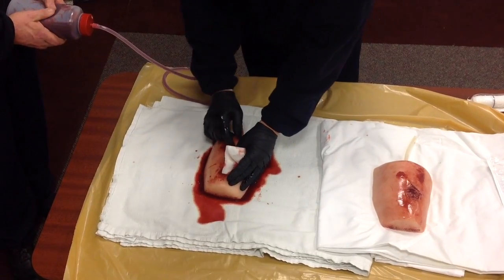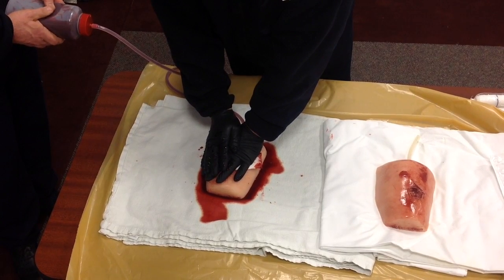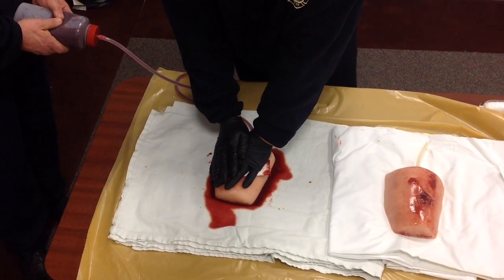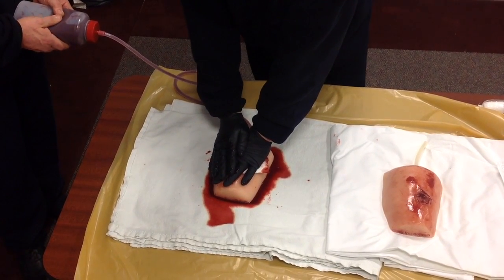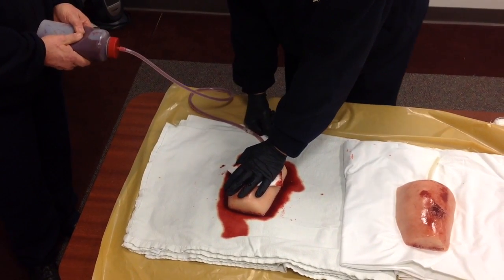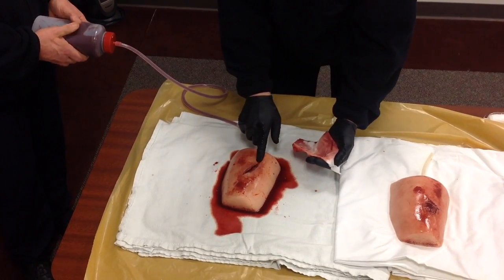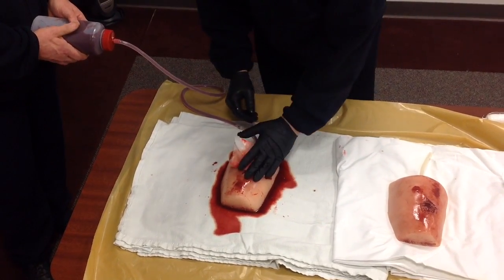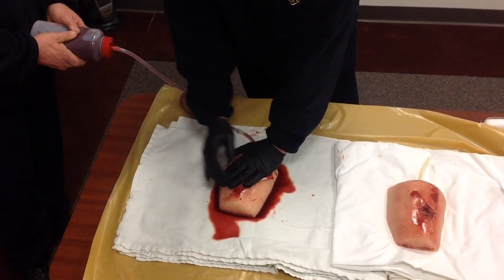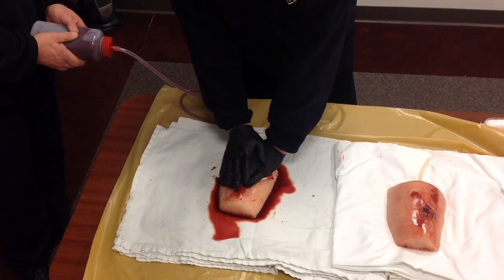You can see it's still pumping, but it's beginning to control. Then apply direct pressure and continue to hold it. Once you get to the point where it begins to clot — because it should start clotting on its own — you'll be able to see how you're doing and it will control the bleeding. If it's still bleeding a little, go back and hold additional pressure. That's how you take care of filling the cavity of a knife or stabbing wound.